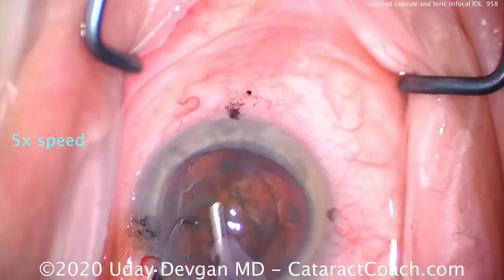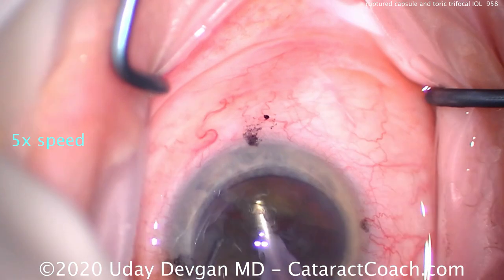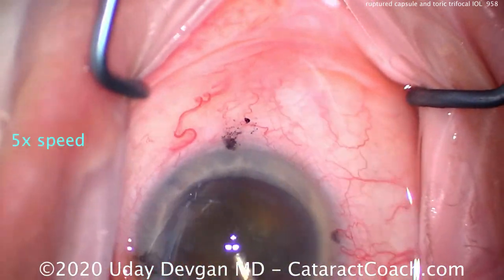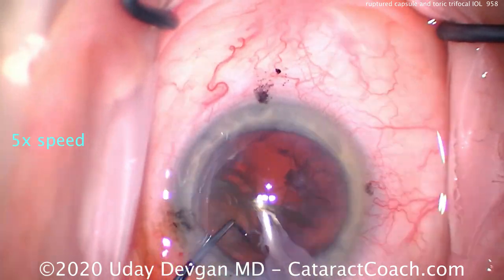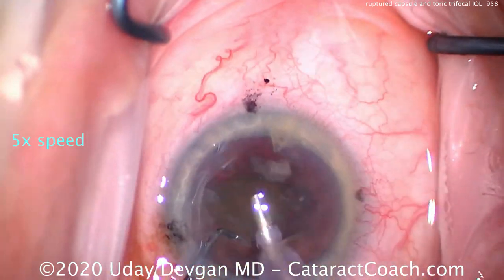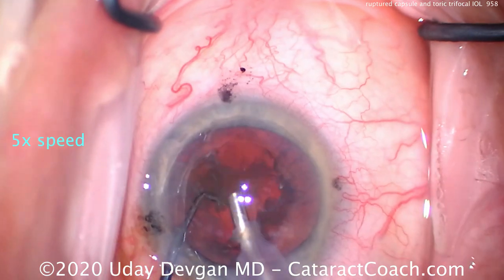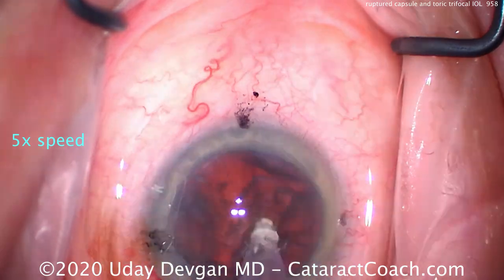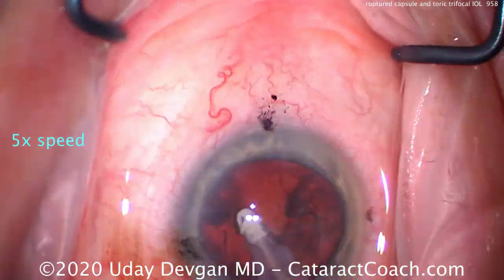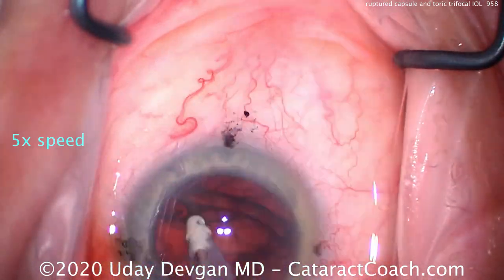Let's watch carefully to figure out where we get the capsule break. When that section comes we'll slow it down. There's the chop — two halves, further sub-chopping. That looks all pretty smooth, no issues here. Rotating the second half around, aspirating that with phaco power being applied — pretty clean.